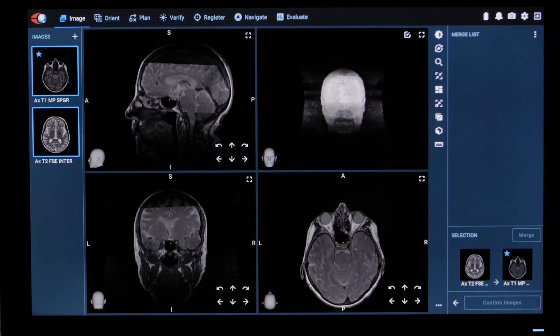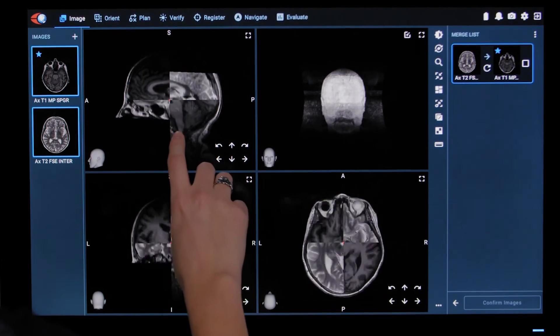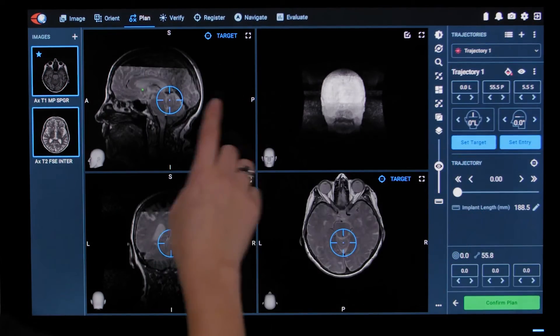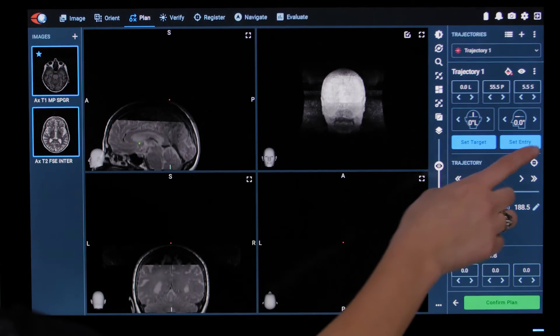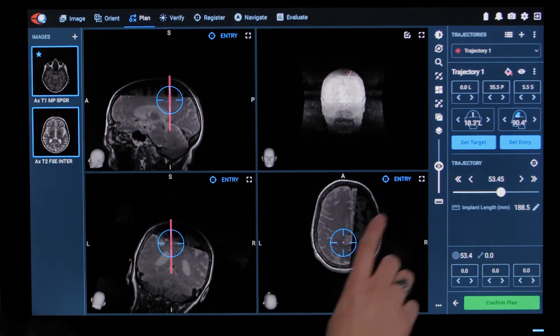MRI and CT images are uploaded preoperatively to plan your trajectories. For DBS cases, you can preoperatively set your ACPC coordinate system to utilize the software's pre-set trajectories for easy planning. Once complete, scroll through each trajectory to verify its placement.